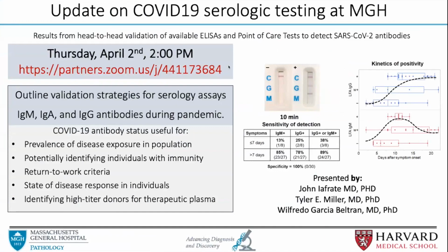This is going to be a very practical overview of how to validate a serologic test. It is currently a very uncharted territory. We don't understand the viral kinetics yet. There are a few papers coming out from several groups, mostly from Asia, where they had longer-term ideas, but we have already gotten some of our kinetic data together.